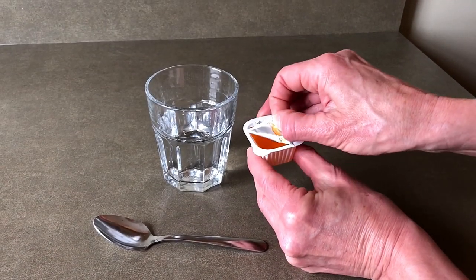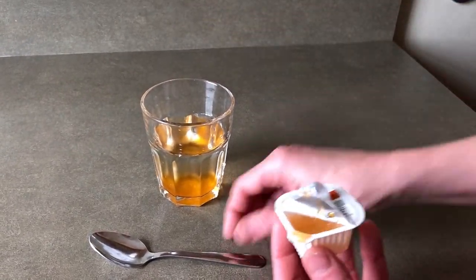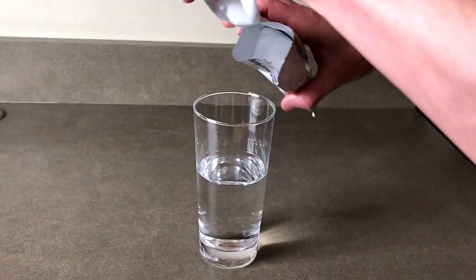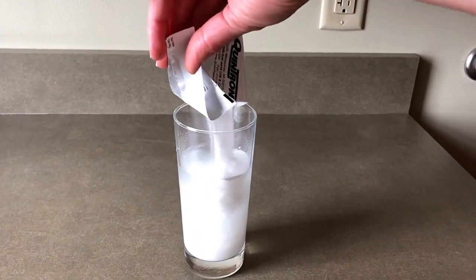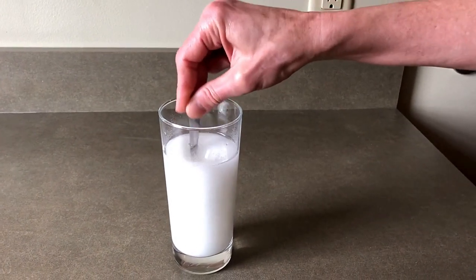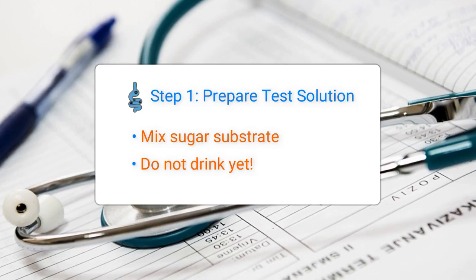The first step is to prepare the test solution. Mix the sugar substrate — either glucose or lactulose — in 8 to 10 ounces of water and set aside. Do not drink yet. Set this aside for after your first baseline breath collection.